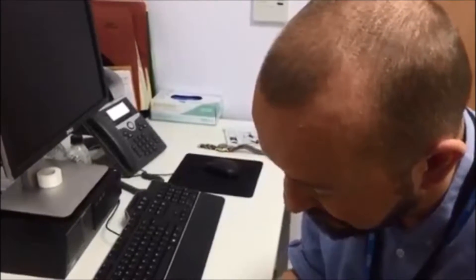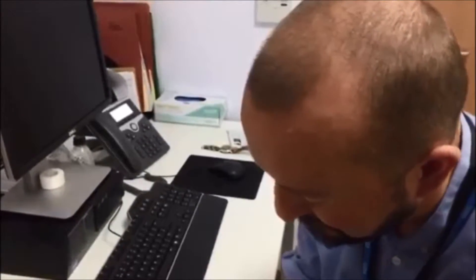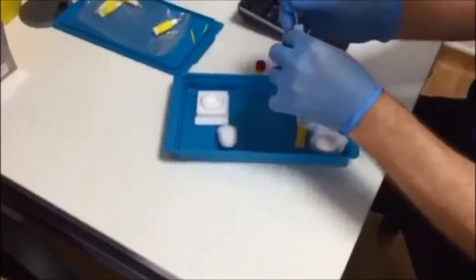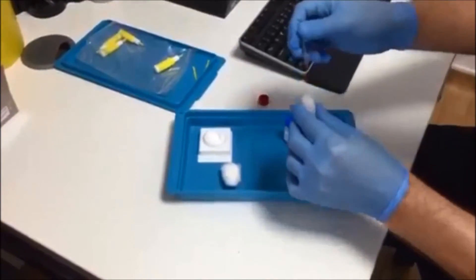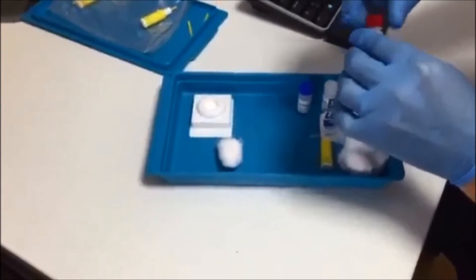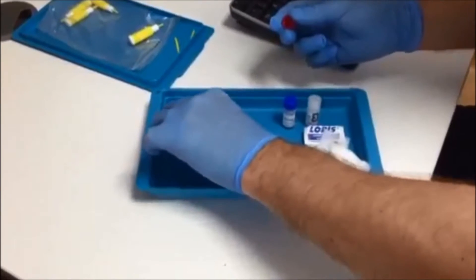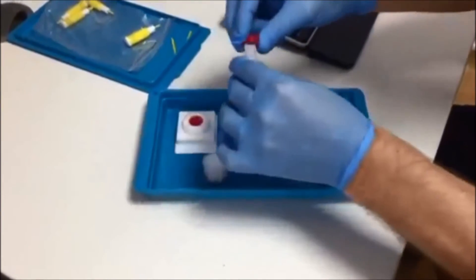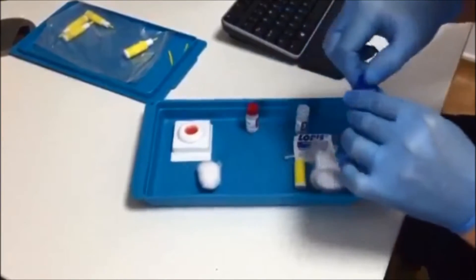We're nearly halfway there. With this test we can get three results: a positive result — if it does come back positive, we'll always redo the test from a venous blood sample in your arm; a negative result; or if it comes back unclear, we'll take another blood sample from your arm and get that confirmed at the hospital lab.